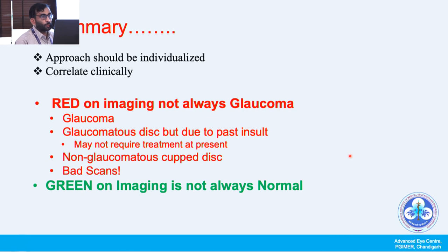To summarize, the approach should be individualized and correlated well with the clinical picture. Redness may mean glaucoma, a previous insult of glaucoma, non-glaucomatous cupping, or maybe a bad scan. Green on imaging is not always normal. Keep that in mind. Thank you.